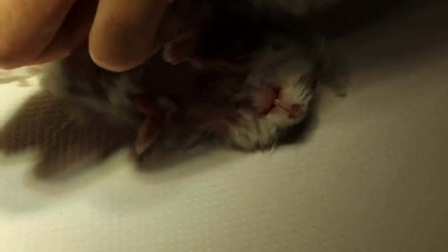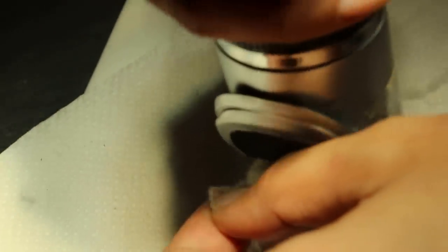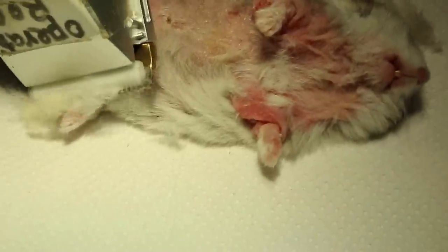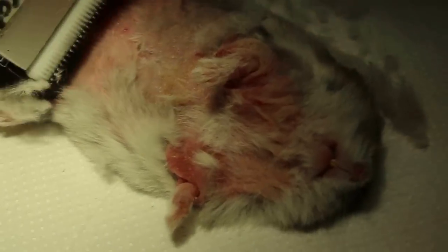From what I can see, this hamster has been biting itself. We must shave faster because the anesthesia is not going to last more than 3 minutes — the gas is easily reversed. If we go too slow, we have to re-anesthetize, which is quite troublesome.